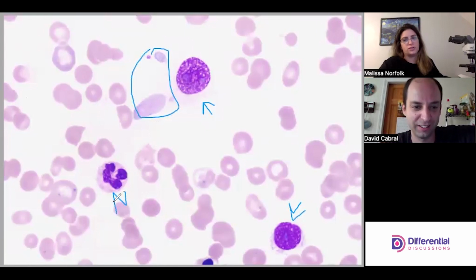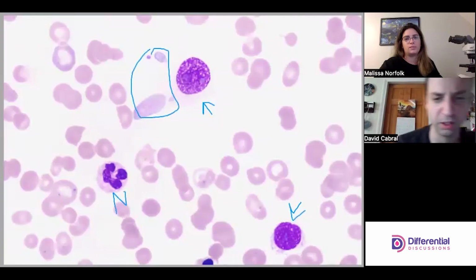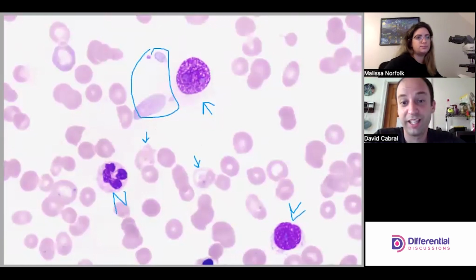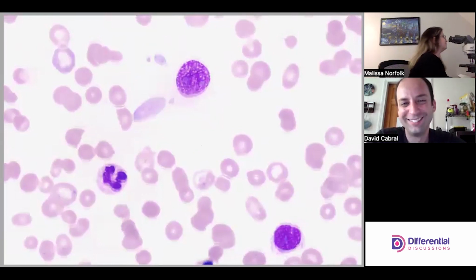And then of course there's inclusions, caps and HJs. And some of these have a target-center-ish field that looks like it's got a weird hemoglobin concentration to it. So this guy looks like a target, this guy looks like a target. So we'll have to keep our eye out and see if we'd call targets. It's probably unlikely we will, I think.